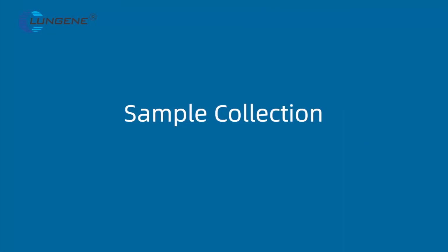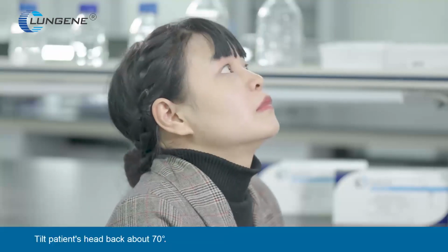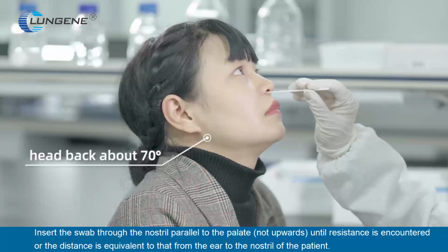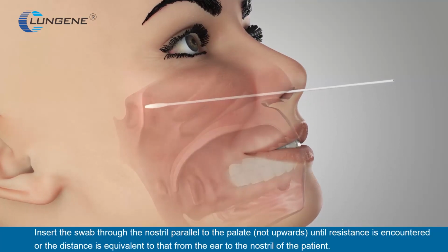Sample collection. Remove the swab from the package. Nasopharyngeal swab sample. Tilt patient's head back about 70 degrees. Insert the swab through the nostril parallel to the palate, not upwards, until resistance is encountered or the distance is equivalent to that from the ear to the nostril of the patient.